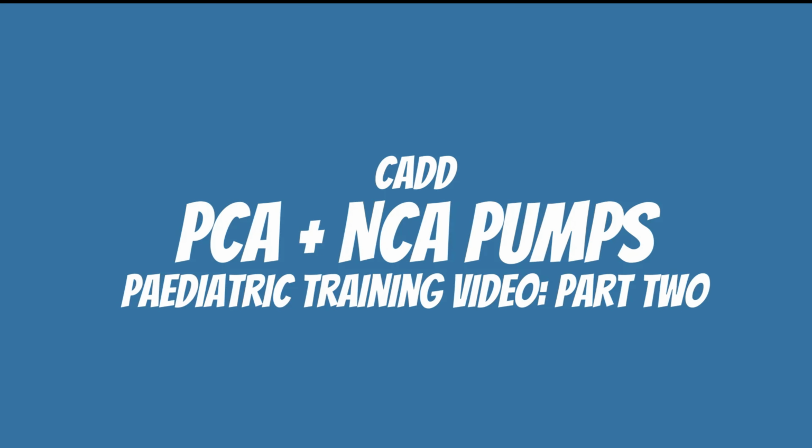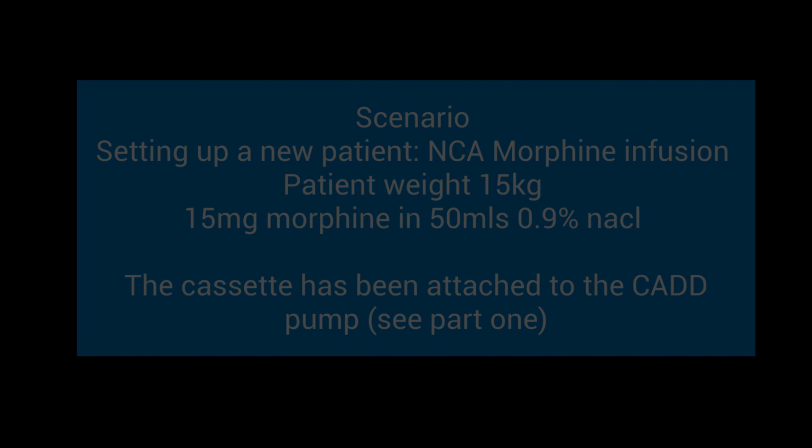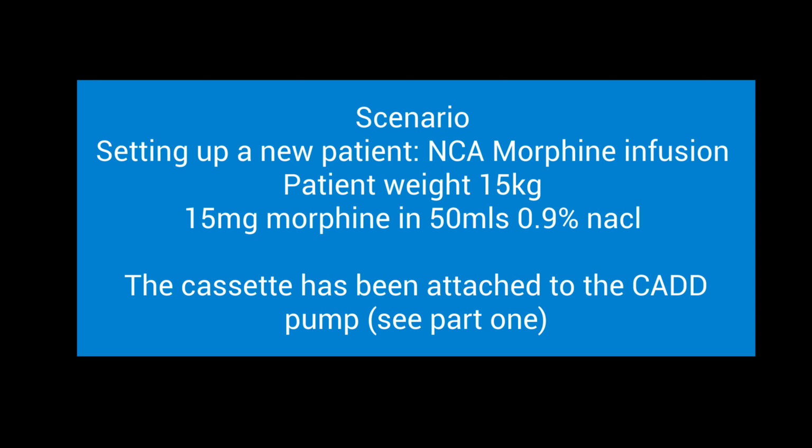This is a pediatric training video demonstrating how to set up the CADD pump for a patient requiring a PCA or NCA, Part 2. The video will focus on setting up a new patient on an NCA morphine infusion.